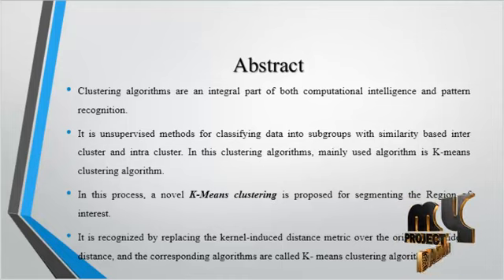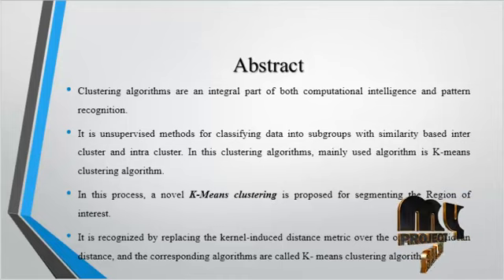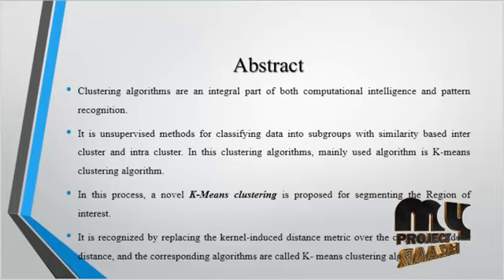With this method, we can segregate the image into 3 or more categories. By these categories, we can segment the region of interest more accurately and finely. Hence, this process achieves finer segmentation by using the k-means clustering methodology.